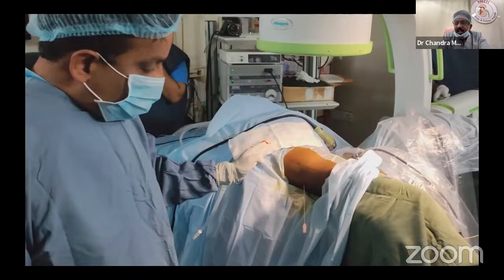If the needle stays in the same place, you are close to the calyx. If the needle goes above towards the head end, it is posterior. That means you are towards the table. Towards the table means back. So in supine PCNL, posterior is towards the table, the back. If the needle is going towards the head end, it is posterior. If the needle is going towards the foot end, it is anterior. That means you have to remove the needle, change the direction by 10 to 20 degrees, and automatically you will go into the calyx.